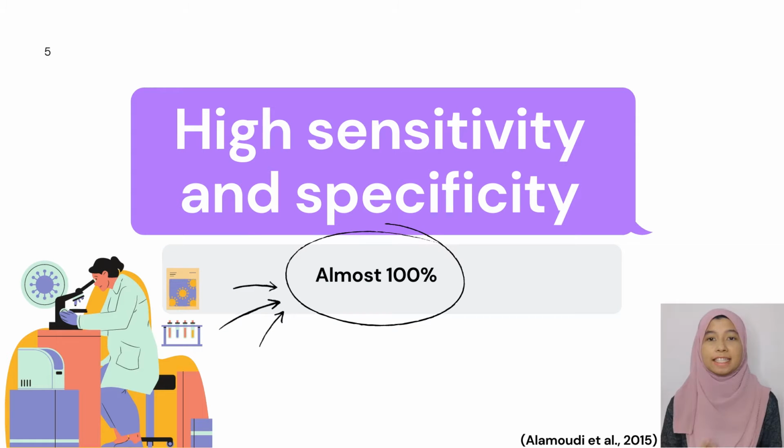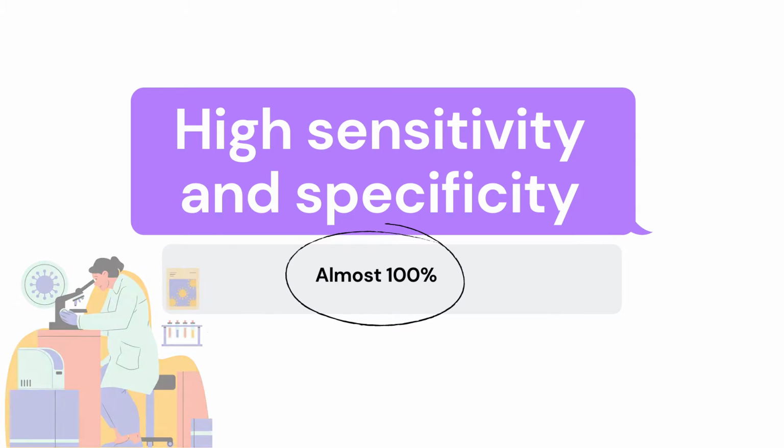This is because the high sensitivity and the specificity that is close to 100%. The high sensitivity of CTA can give a detailed analysis of the extent of the aneurysmal disease by accurately detecting the size of the aneurysm.